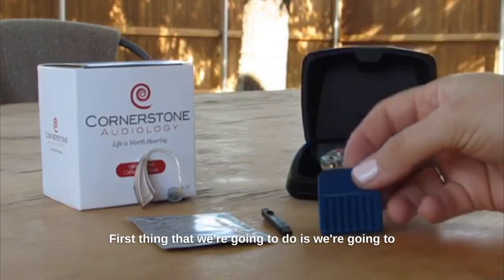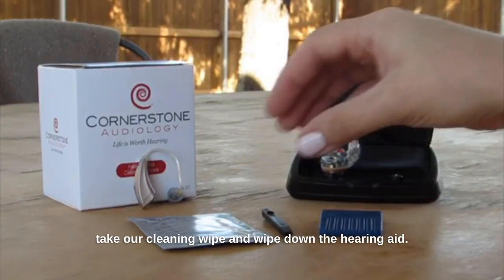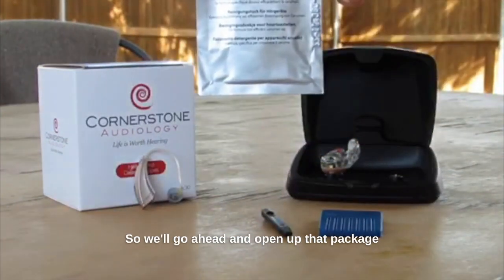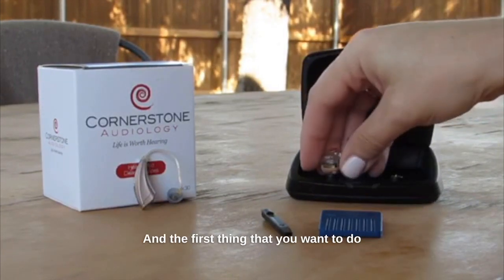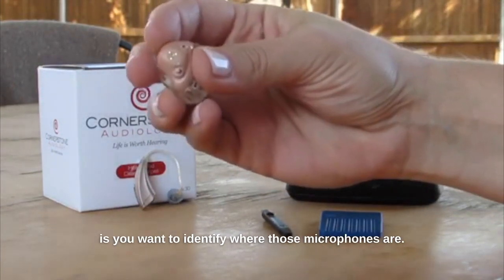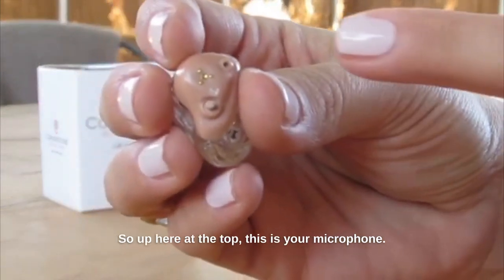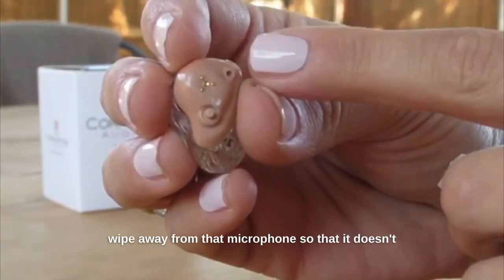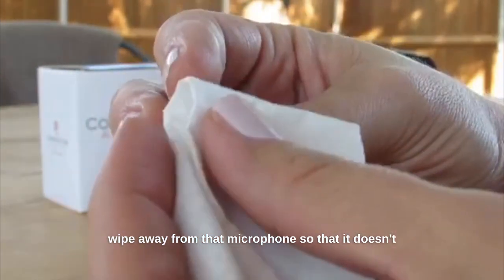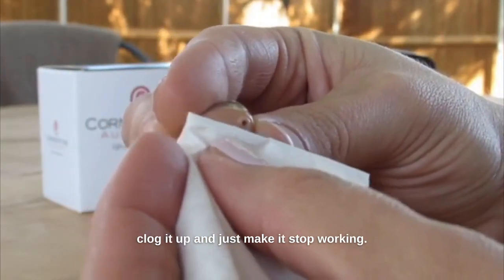First thing that we're going to do is take our cleaning wipe and wipe down the hearing aid. So we'll go ahead and open up that package. And then we're going to take our hearing aid, and the first thing that you want to do is identify where those microphones are. So up here at the top, this is your microphone. We want to make sure we keep our alcohol wipe away from that microphone so that it doesn't clog it up and make it stop working.